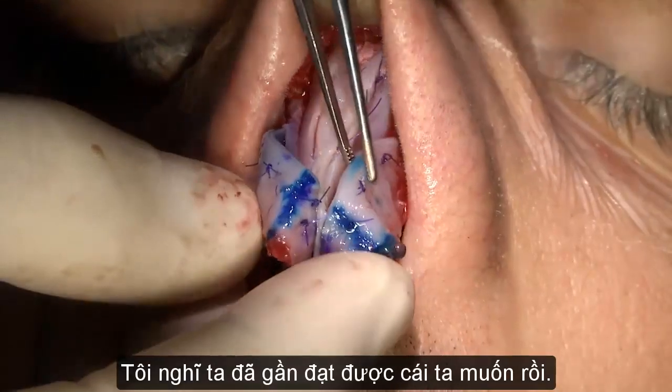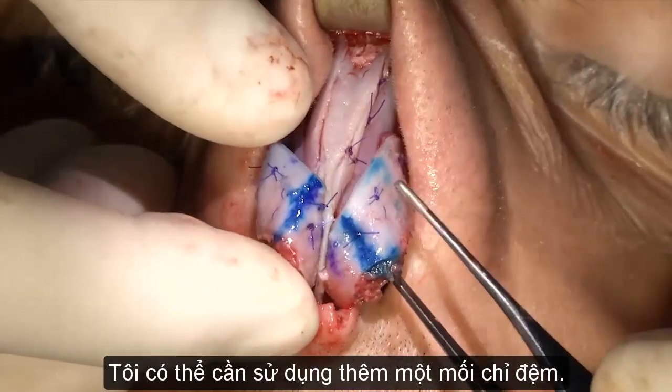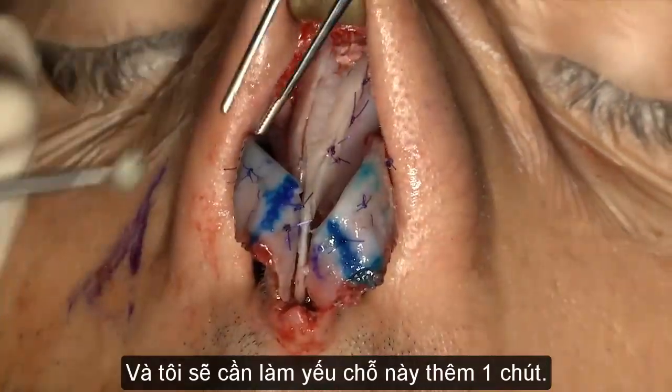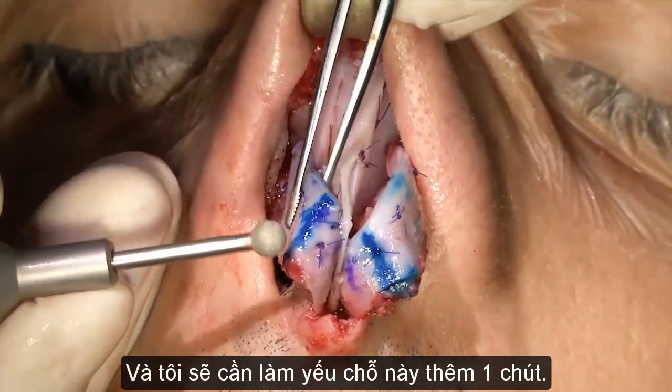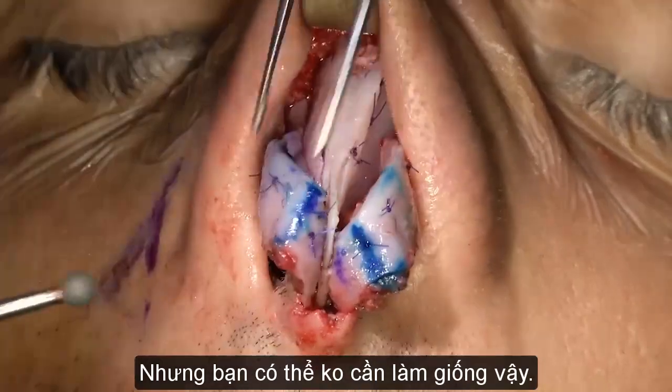I think we are getting there progressively. I may use one of the mattress stitches, and I want to weaken this just a tiny bit. But you don't have to do this.